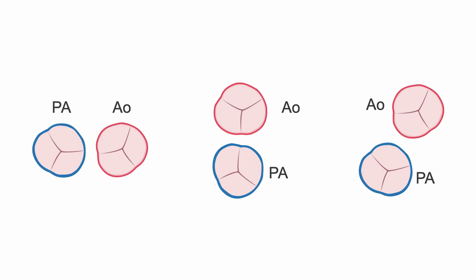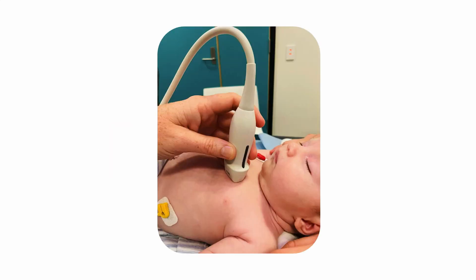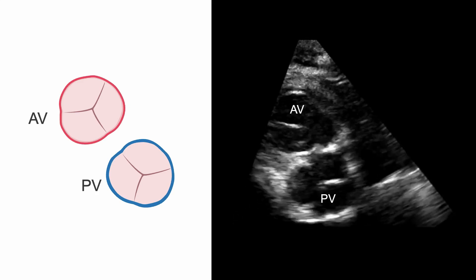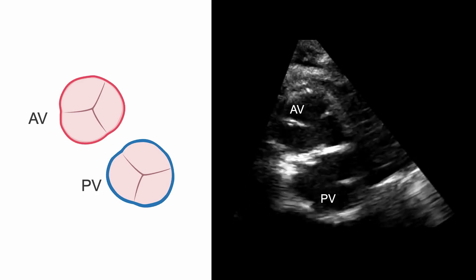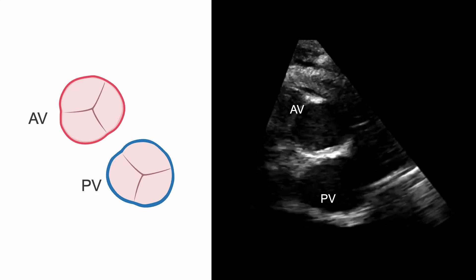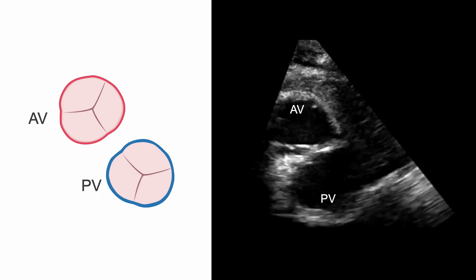It's important for the surgeon to be aware of the position of the great vessels prior to surgery. The parasternal short axis view is used to profile the aortic and pulmonary valve leaflets. Both the aortic valve (AV) and pulmonary valve (PV) are often normal with thin and mobile leaflets.